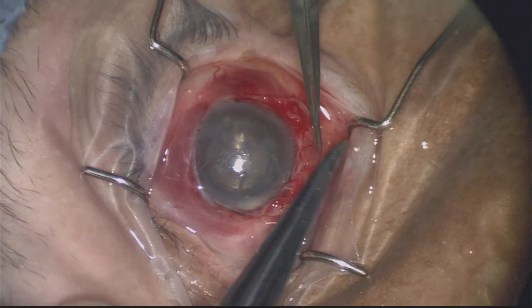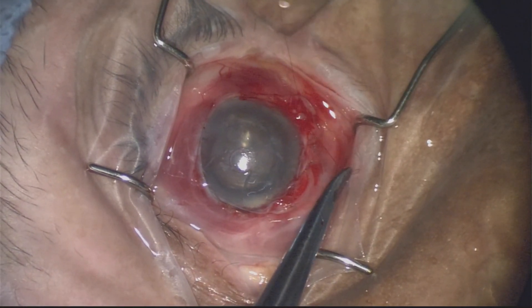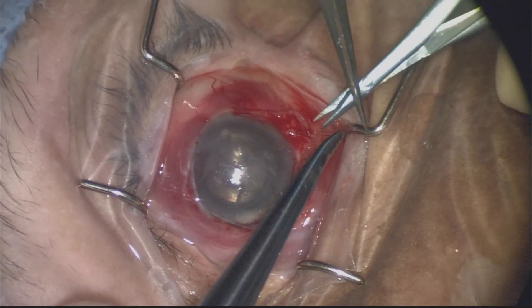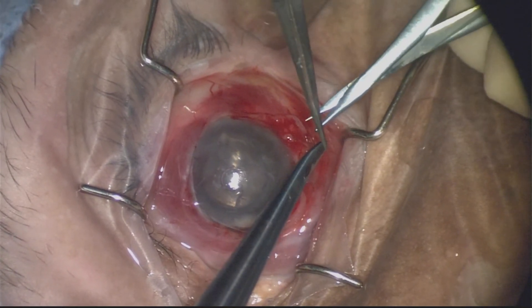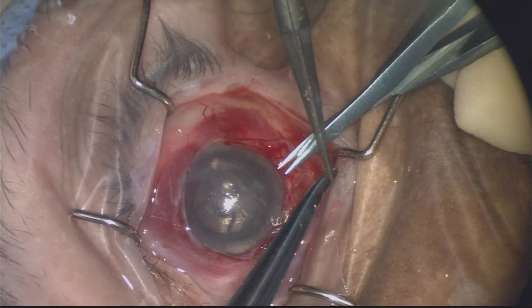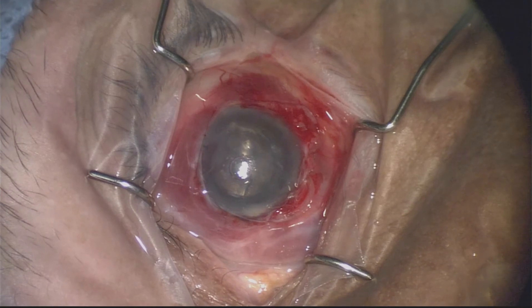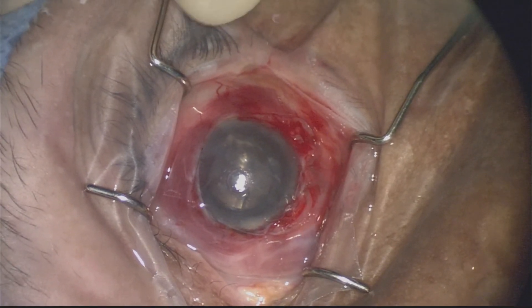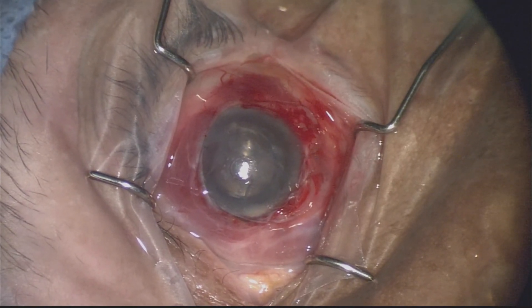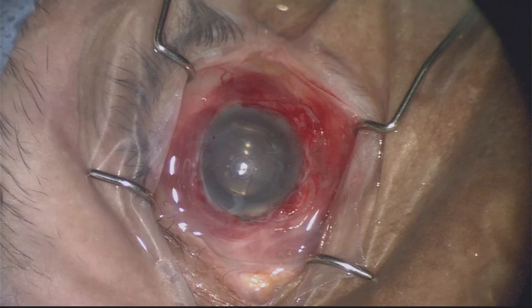The main aim is to minimise the level of vascularisation that happens. This patient still has stem cell deficiency, so you won't be creating a completely clear ocular surface, but you want to prepare it as much as possible for the next procedure — a stem cell transplant. If the cornea doesn't look as clear as expected and there's significant stromal scarring, you may also consider a corneal graft. This video shows the situation faced with a limited view in stem cell failure and the steps to minimise complications during cataract surgery.